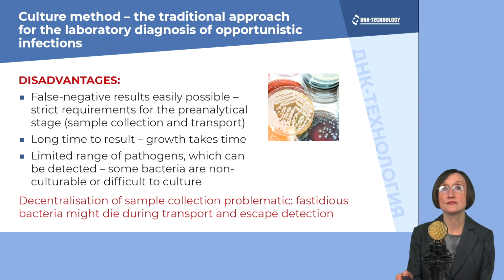Culture-based methods generally used for the detection of opportunistic facultative anaerobes have a number of disadvantages. They often lead to false negative results or incorrect analysis results. Decentralization of sample collection is problematic. Fastidious bacteria might die during transport and escape detection.